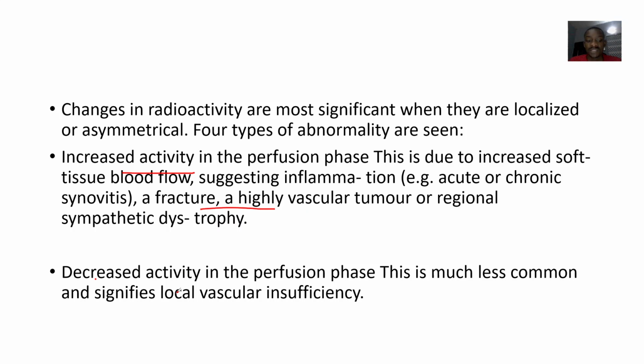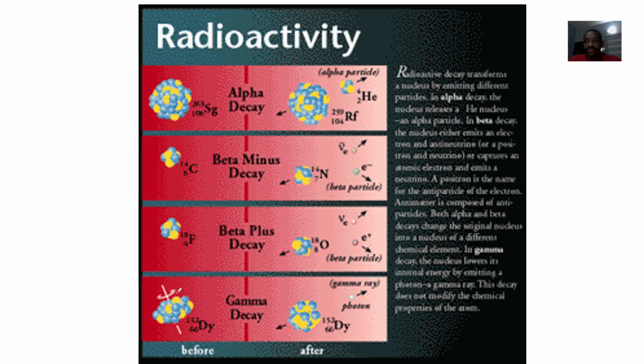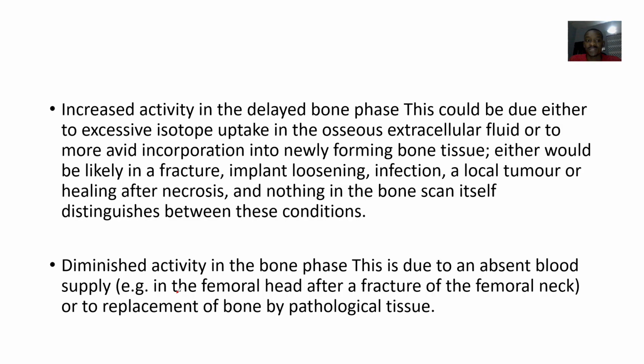If there's a decrease in radioactivity, the other way around, it usually signifies that the blood supply is reduced or insufficient, right? Blood supply is reduced or insufficient. That is one of the causes of a reduced radioactivity.